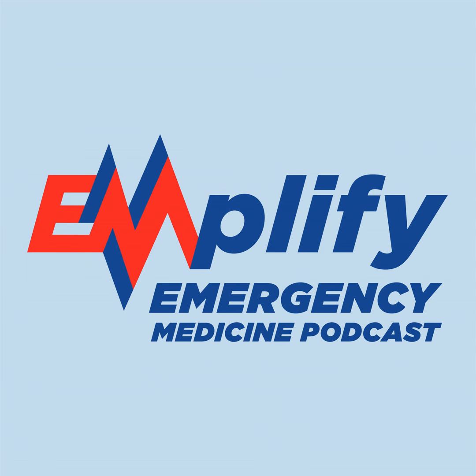So I think a lot of your bedside adjustments can be done based on waveform capnography and pulse oximetry. The pulse oximeter, if it's reliable and your patient has normal perfusion and nothing else that confounds, is a great surrogate marker for changing your FiO2, because it's a good surrogate marker for your PaO2. I usually want, at least early on, an ABG or VBG to understand if the waveform capnography is a good estimate of the patient's actual PaCO2. And if it is, I'm still going to be verifying later with blood gases, but I might be happier looking at trends in waveform capnography based on how those numbers are changing at the bedside.